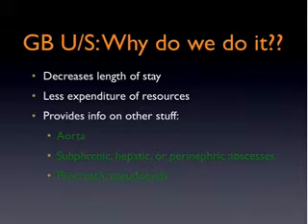Before we launch into a discussion of gallbladder pathology, let's talk about why we even do ultrasounds in the first place. Well, studies have shown that it decreases the patient's length of stay in the emergency department, that there's less expenditure of resources. It really focuses your technique as well in your diagnostic studies, such that perhaps a patient will be spared a CT scan.